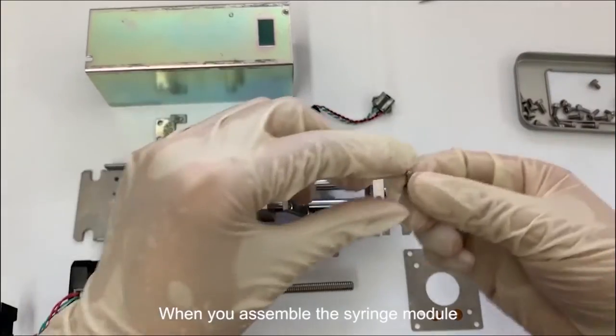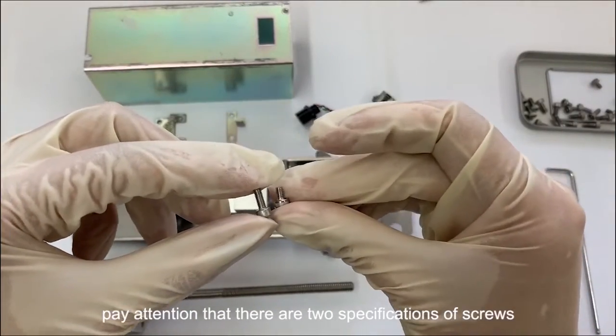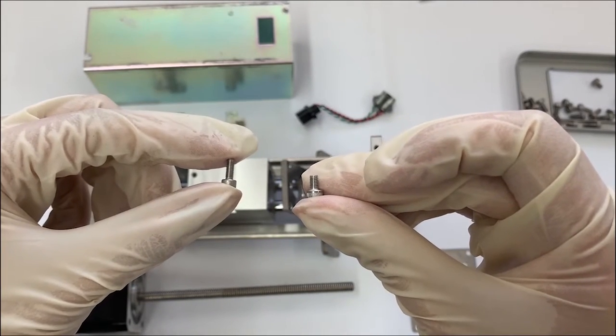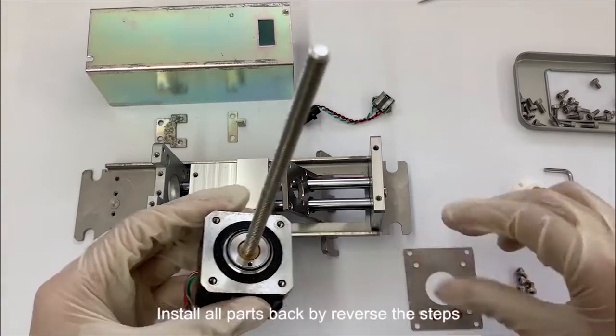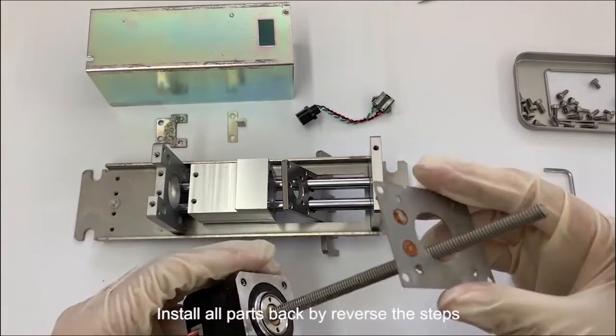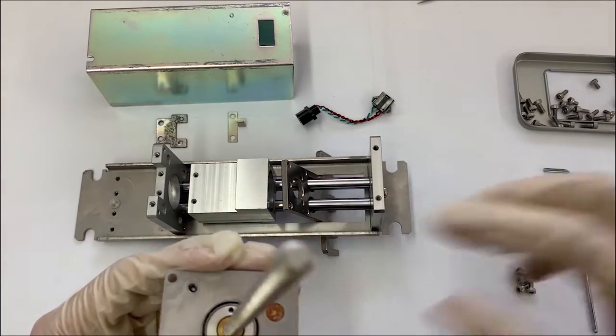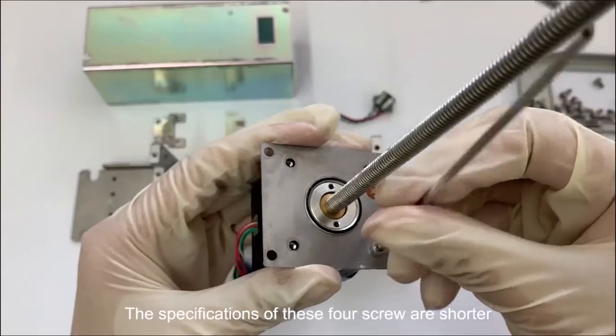When you assemble the syringe module, pay attention that there are two specifications of screws. Install all parts back by reversing the steps. The specifications of these four screws are shorter.